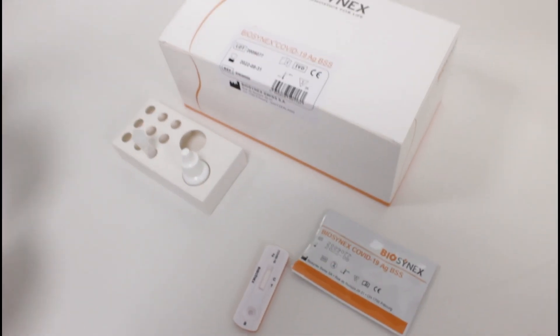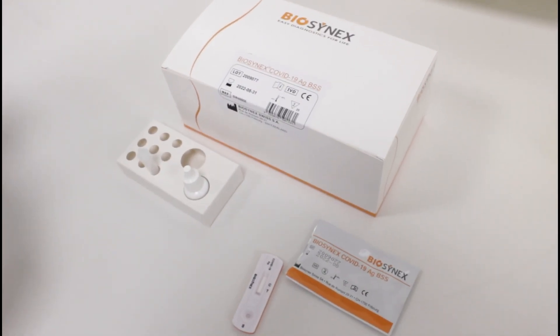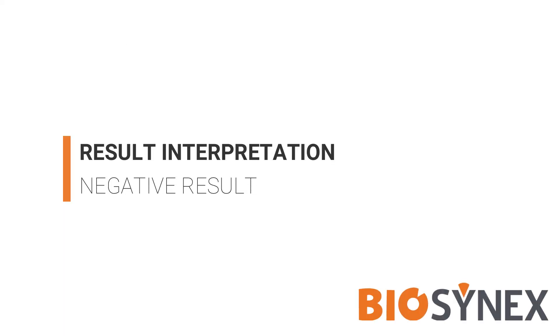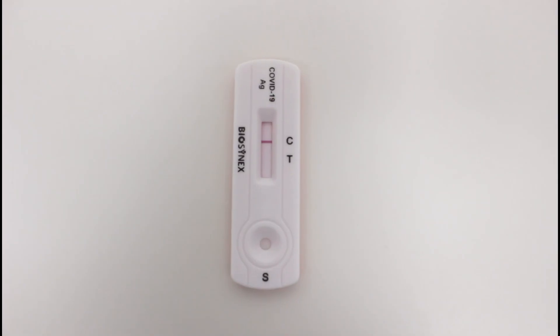Set a timer for 15 minutes and interpret the result after 15 minutes. If only one coloured line appears in the C area, the test is negative.